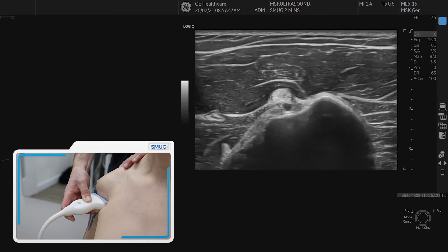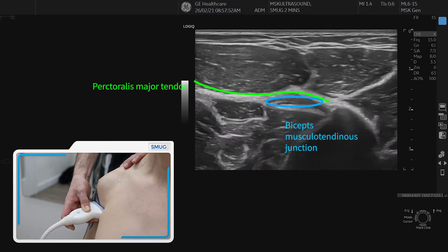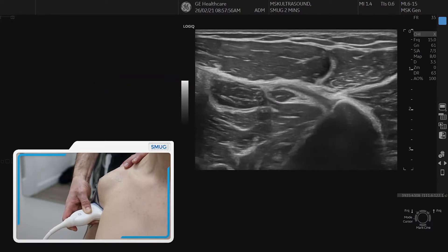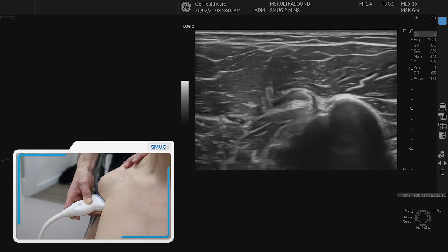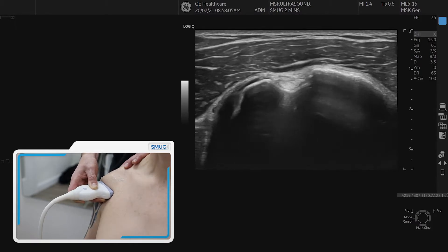Keep the tendon nicely in the middle until you reach the level of the pectoralis major, which is the tendon coming from the left, and that's the musculotendinous junction. You see the muscle coming up there underneath the pectoralis — musculotendinous junction of the biceps. You go back proximally, keep the biceps nicely in the middle until you're back in the bicipital groove.